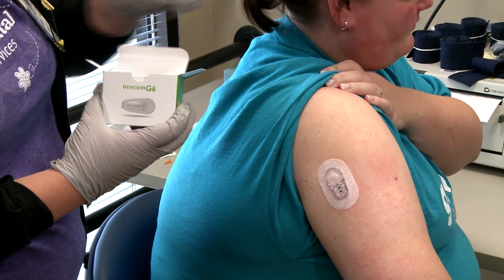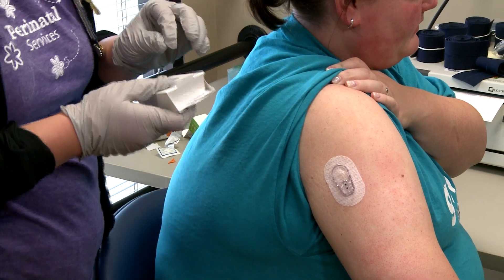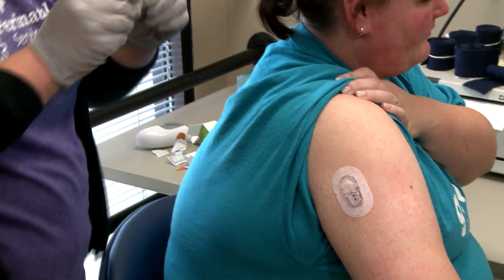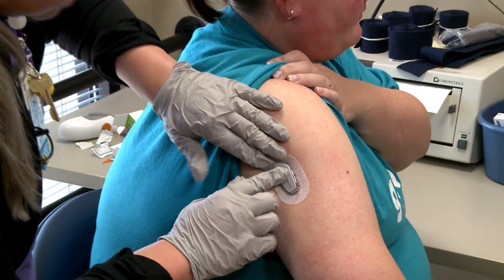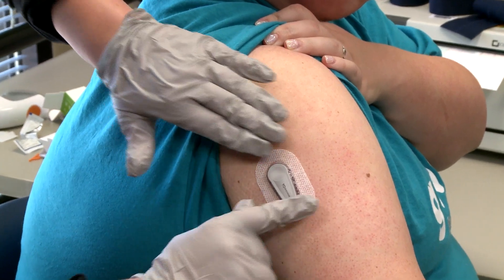This is our little Bluetooth transmitter piece that talks to your app. You're going to insert the skinny end, and then you'll kind of push on that bigger end, and you'll hear that click — so then it's all in place.